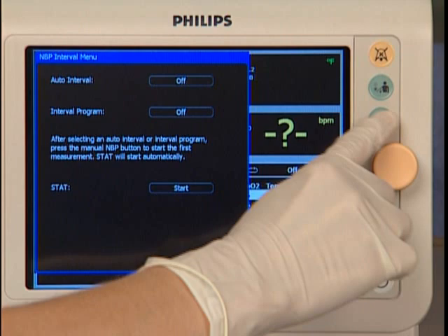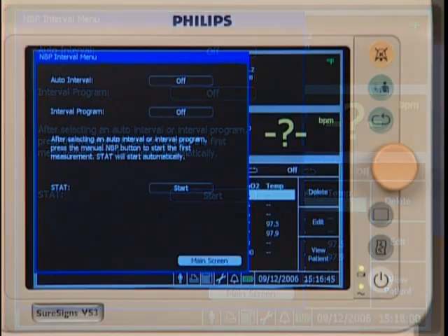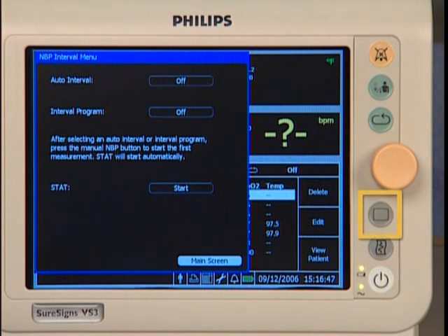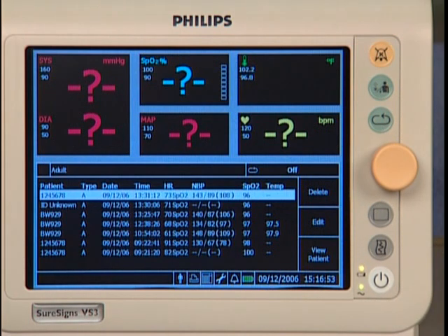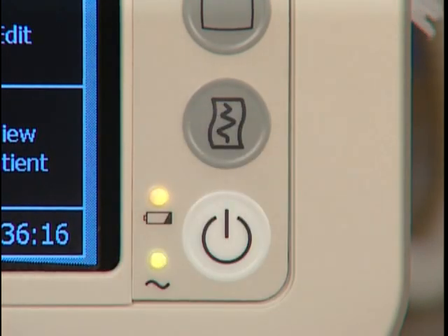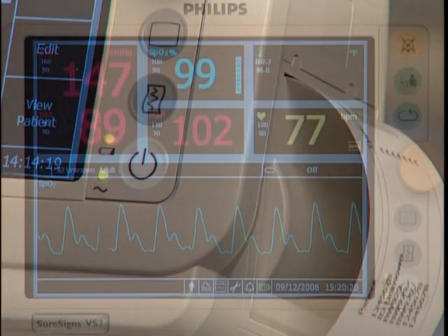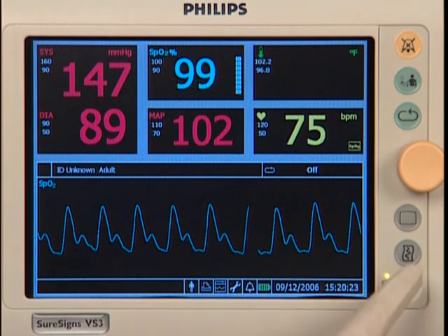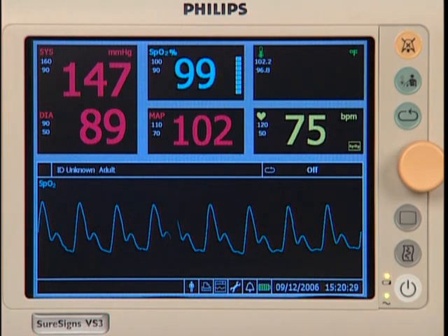Press this button to open the NBP interval menu to select an auto-interval or an interval program for NBP measurements. This is the main screen button — press it to exit a menu and return to the main screen; any changes made before exiting are saved. Press the print button to produce a printout of the most recent patient's vital signs data. If the SpO2 waveform is displayed, pressing the print button prints a 7 or 20 second strip of the wave and all current vital signs measurements.